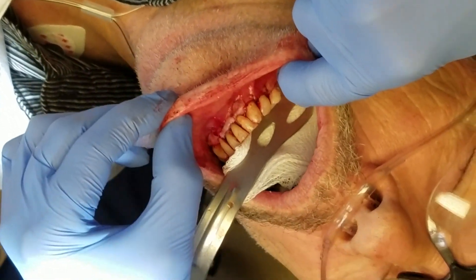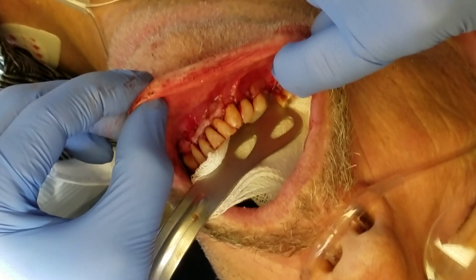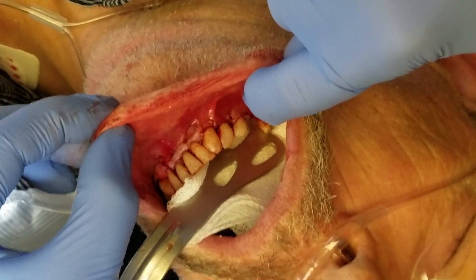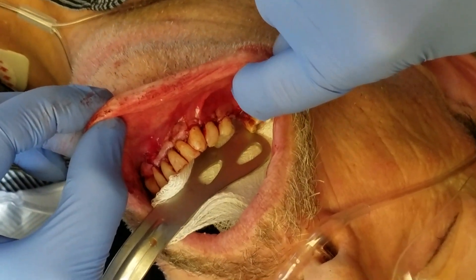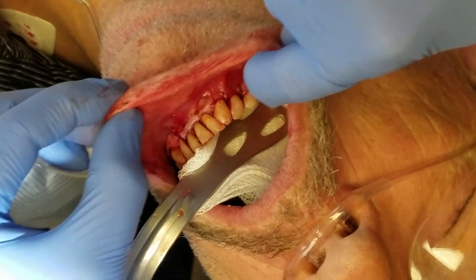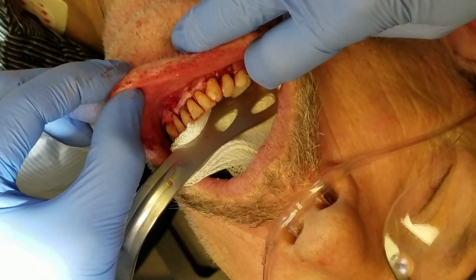Let's take a pan out of this — everything's all stitched up and closed nicely with 3-0 chromic gut suture. Now we're just going to let things heal.